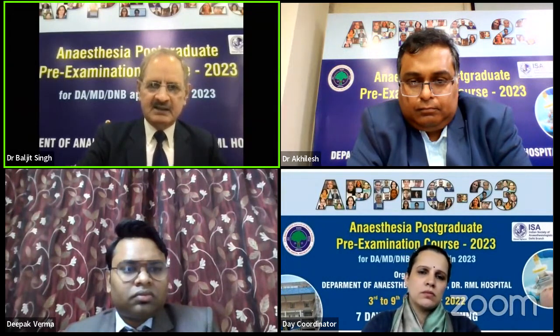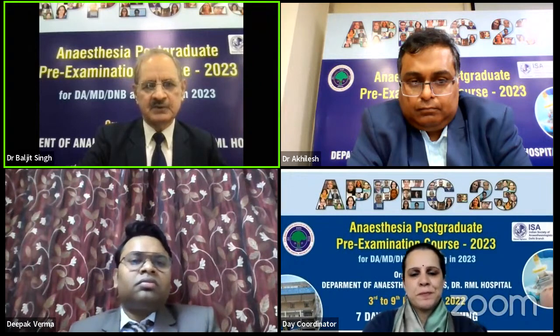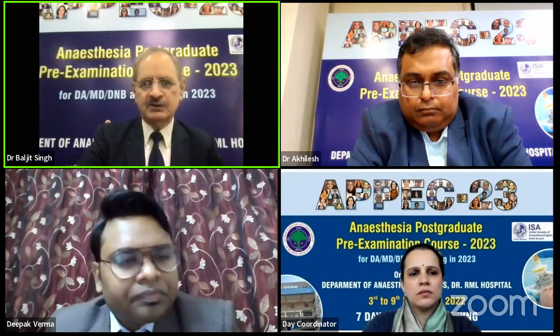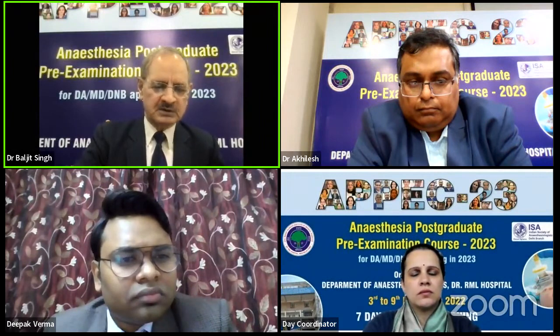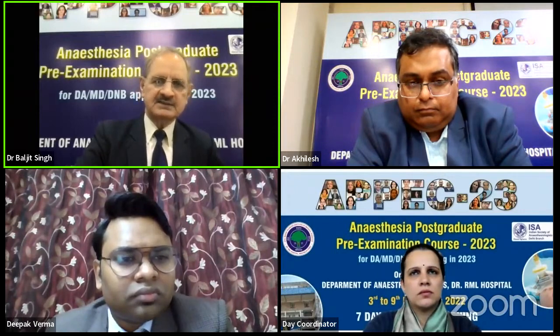Cylinder testing, again, Dr. Akhilesh has touched upon, is normally done every 5 years. And sometimes with extended testing, it may be after 10 years. Also, there are various tests. One of the most commonly performed tests is the hydraulic test, where they put in water and pressurize it to nearly 2 times its service pressure, and that is the hydraulic test, which determines the safety of the cylinder. Every 5 years this is done.